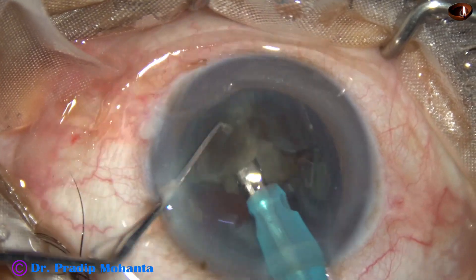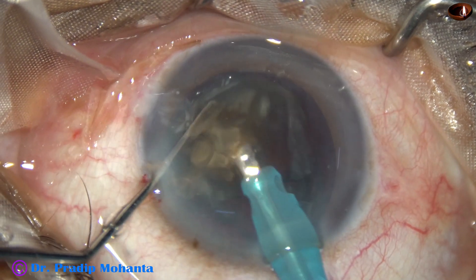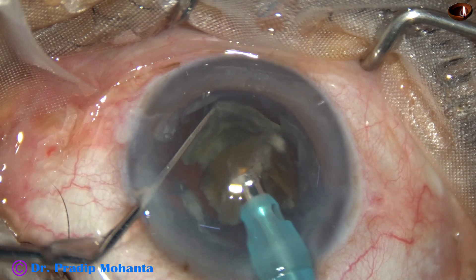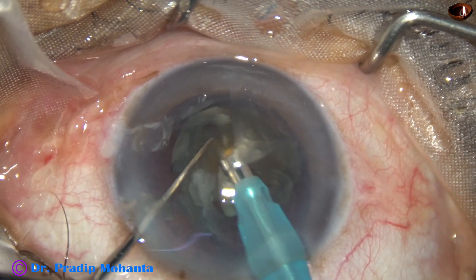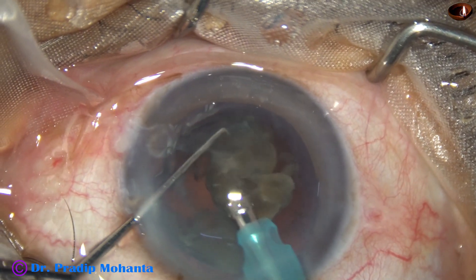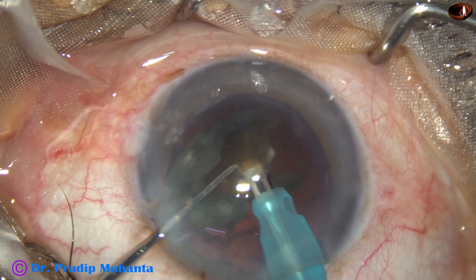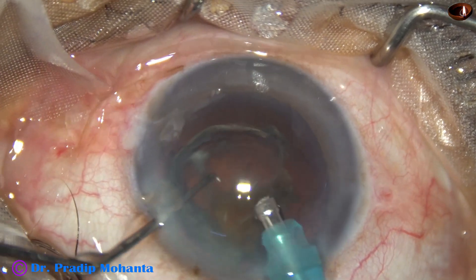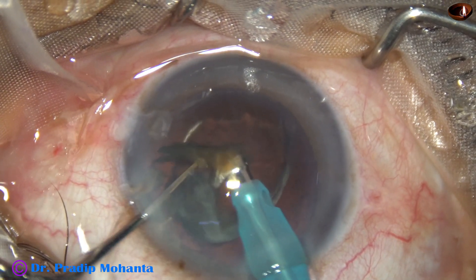We come to the last fragment. See how I am trying to protect the posterior capsule. I remove the epinucleus from the nuclear piece and use the epinuclear shell as a cushion. The epinucleus is acting like a boat — using it as a cushion — and over this epinuclear shell I am emulsifying the hard nucleus, and it is done.